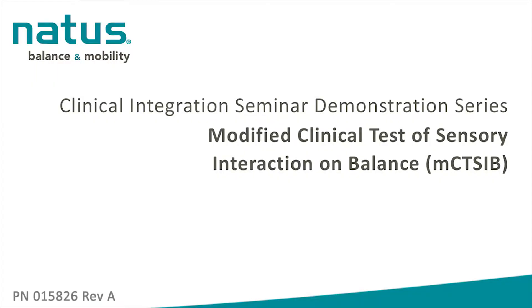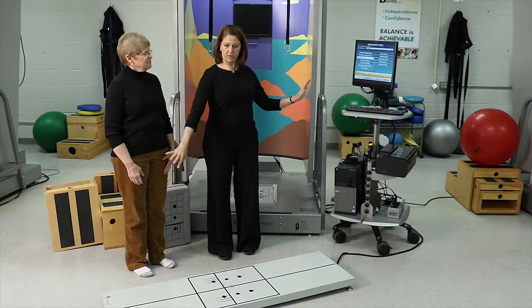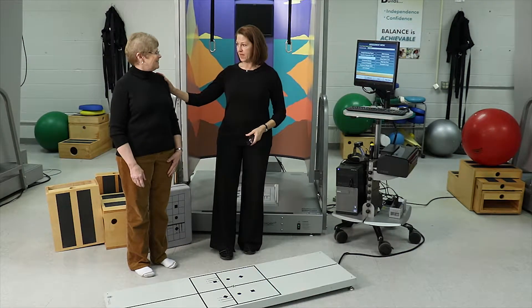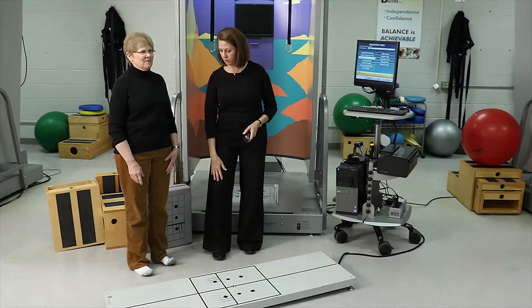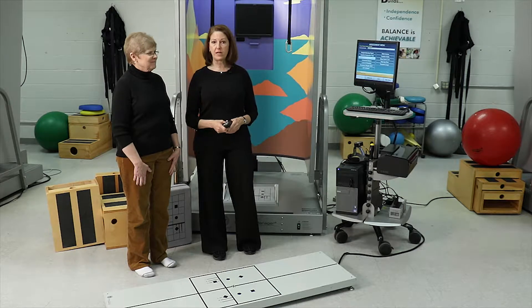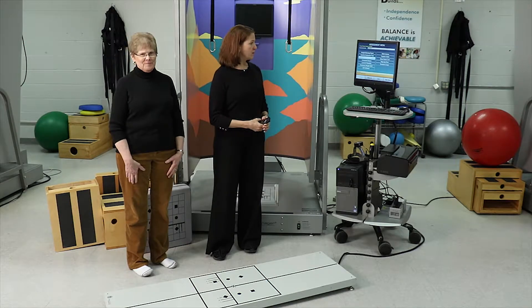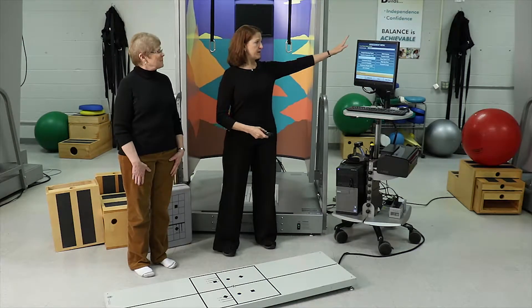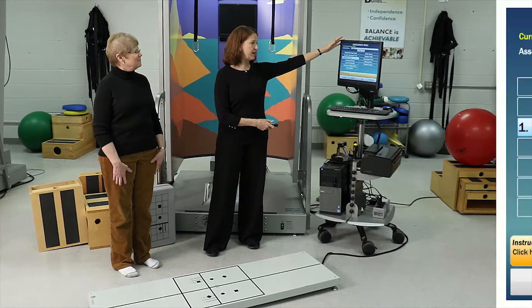We're going to be demonstrating the modified Clinical Test of Sensory Interaction on Balance, or the modified CTSIB, on the balance manager system with the five-foot force plate. Liz is going to help us out. She's a 67-year-old lady who has a right total knee arthroplasty and a left knee with a little bit of arthritis, so she has some difficulty with her balance. We are in the static force plate activity-based assessment menu and I'm clicking on modified CTSIB.